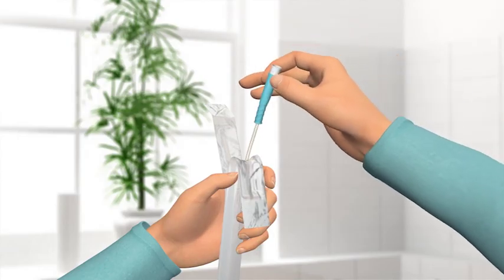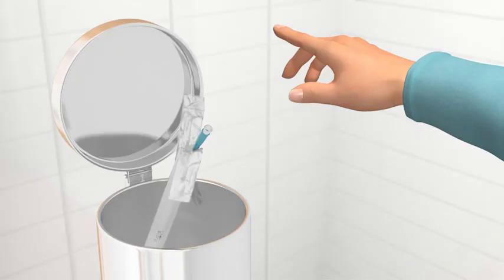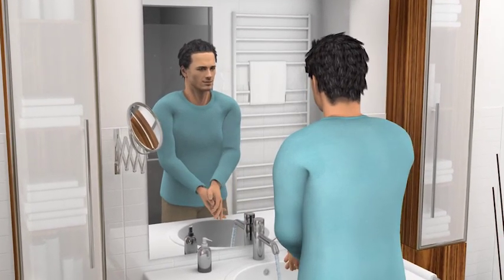You can dispose of the catheter and the packaging in your household rubbish. Do not flush it down the toilet. Wash your hands, and you have completed the process.